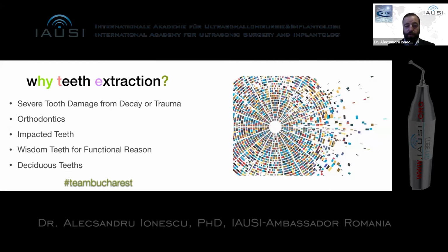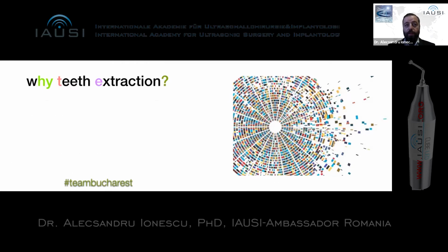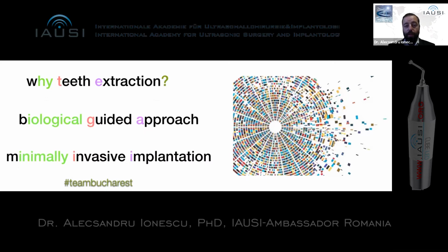Also, for the resident teeth, we have some functional problems when we are talking about interferences or contacts on the functional movements, and also for the temporary teeth. But our main interest in nowadays dentistry, especially when we are talking about implant dentistry, is that we need to extract the teeth for our future implant planning in a minimally invasive way.